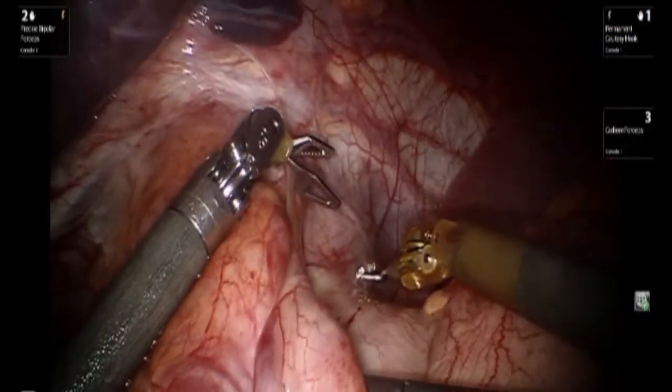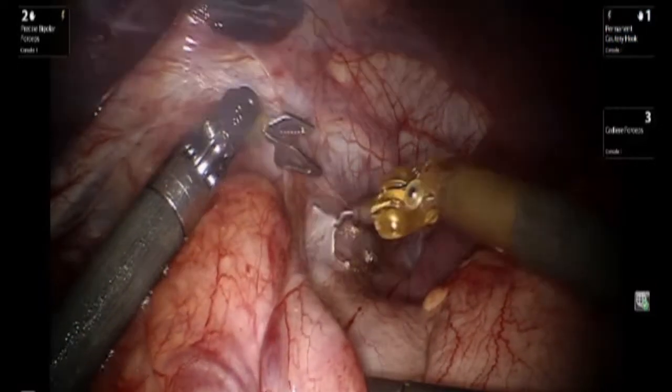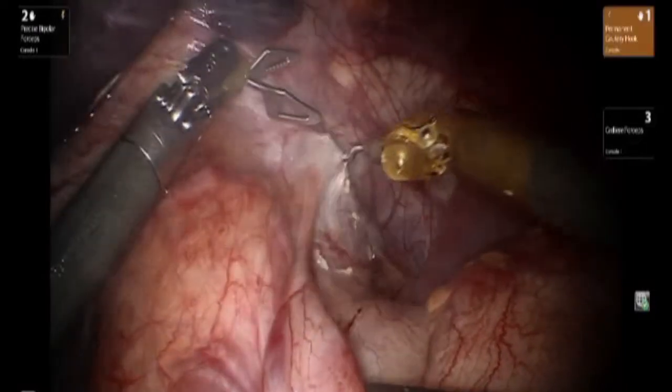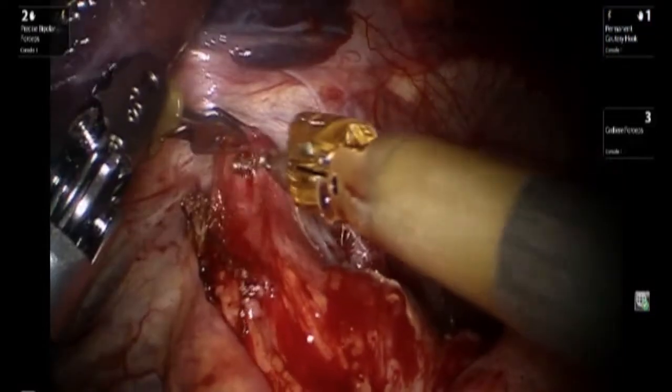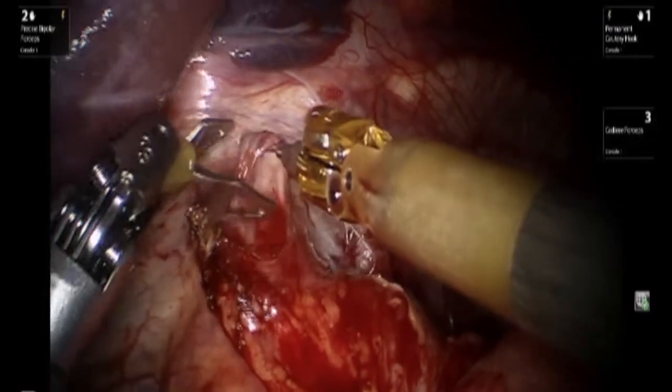We begin the procedure by opening up the peritoneum overlying the angle of His, and the dissection continues overlying the loose phrenoesophageal ligament until we're able to visualize the posterior mediastinum.